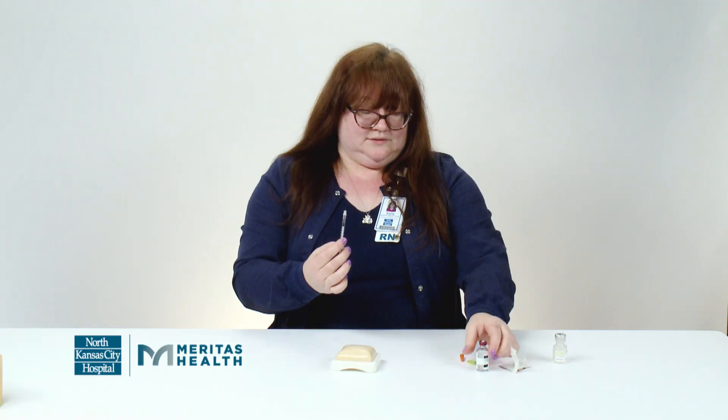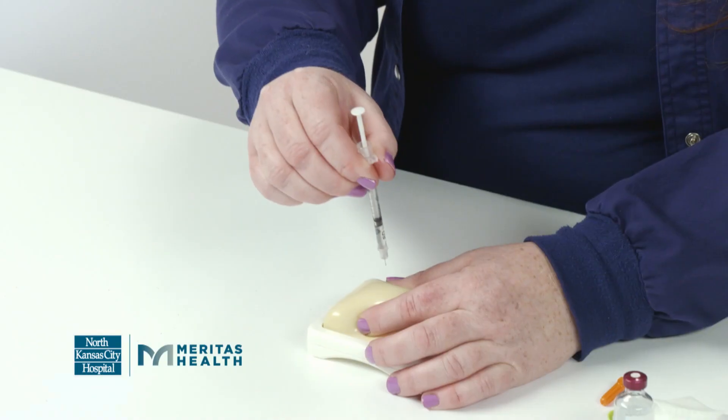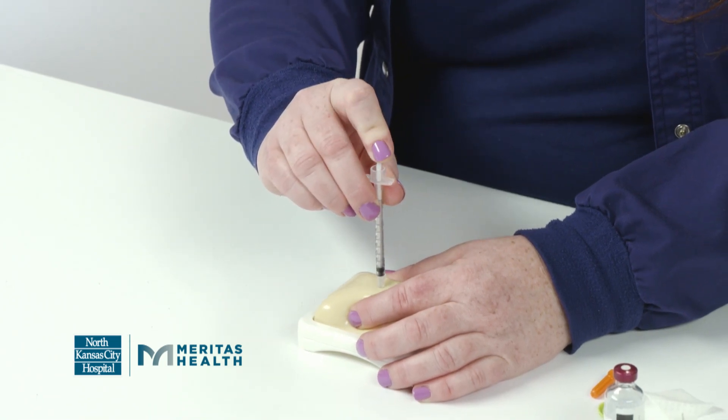Now you take the syringe out. Next you're going to wipe your skin off with an alcohol wipe. Push up your skin, put the syringe in your skin, and push down on the plunger.